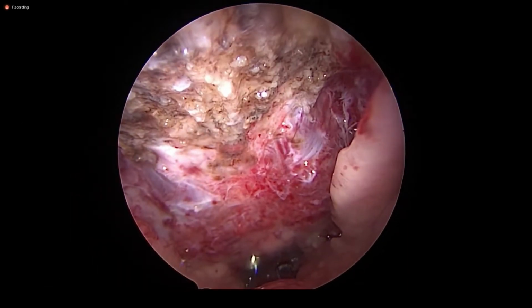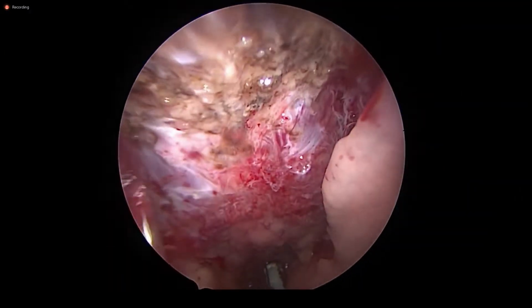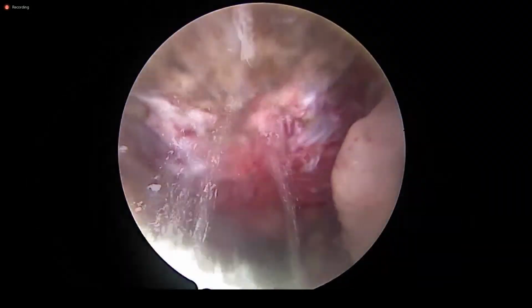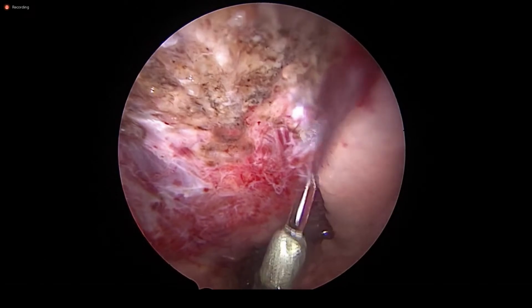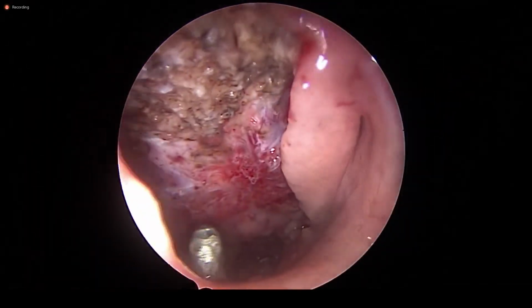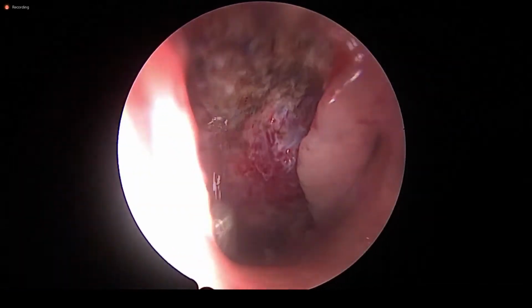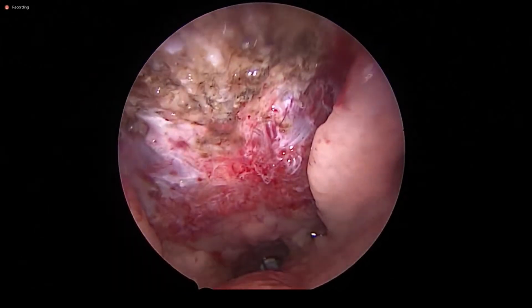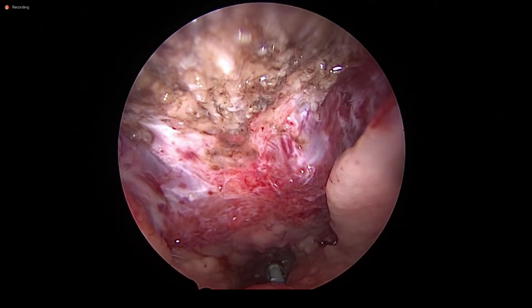See this? How's the picture there? Excellent, sir. Excellent. You are using a 4 mm 0 degree endoscope, no? Yes, 4 mm 0 degree.